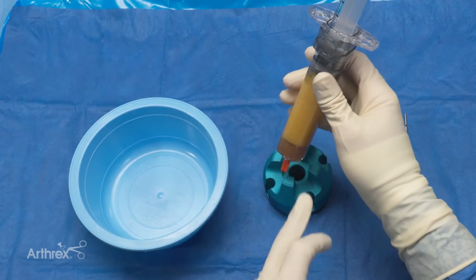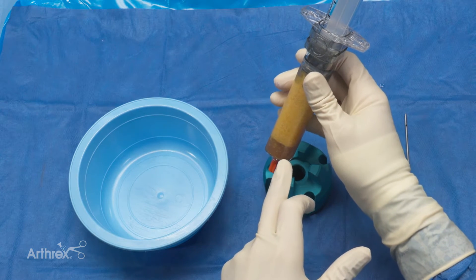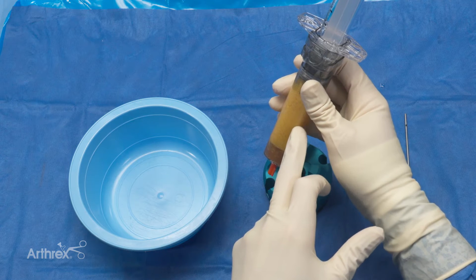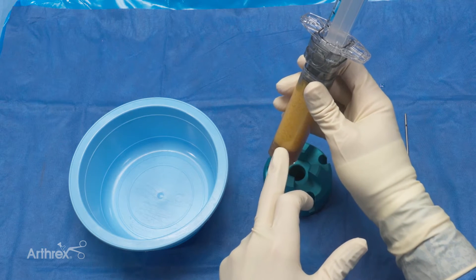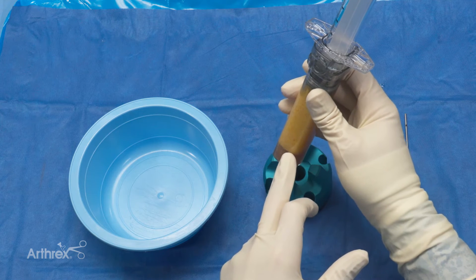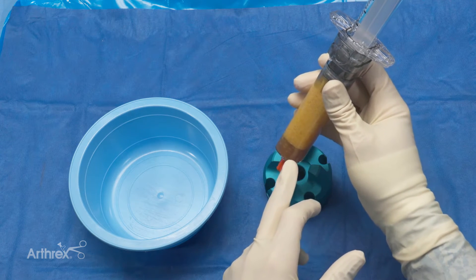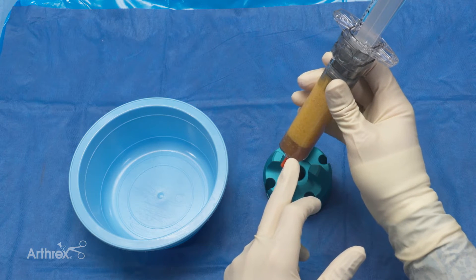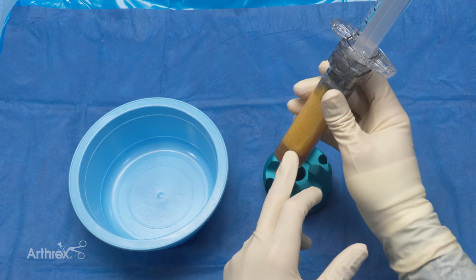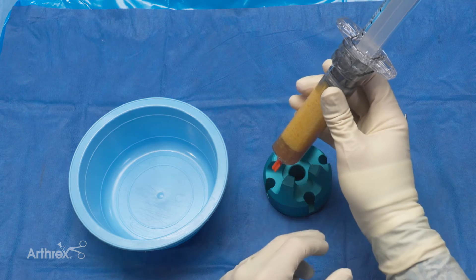Now that we've let the adipose restore syringe sit for five minutes, we've clearly got a fluid separation where the infranatant has come off. You'll notice the adipose here is very yellow — it's not going to look like this in live patients; it will have a bit more of a red tinge to it. It just looks this way because we're working on a cadaveric specimen today. The purpose of the decanting and rinsing steps is to remove cell debris and red blood cells, which we're just lacking in this specimen.